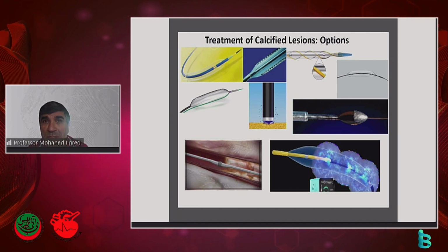And of course, IVL has become very, very prevalent because it's easy equipment to use. It's a balloon like anything else that we use on a day-to-day basis, except it's a little bit more bulky, so that makes it sometimes a little difficult to deliver. You'll be familiar that the new balloon has come out in the market, and we've been using it for a couple of months, which gives you 120 pulses rather than 80.